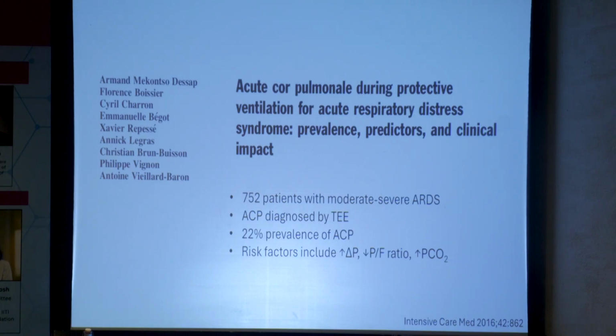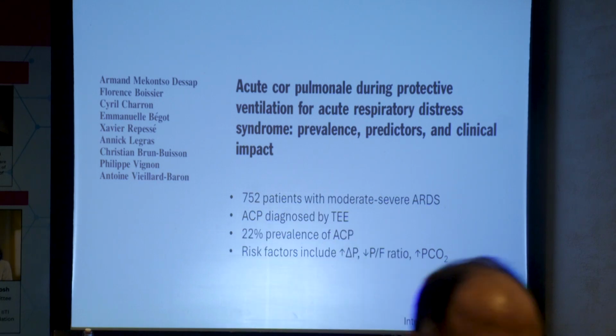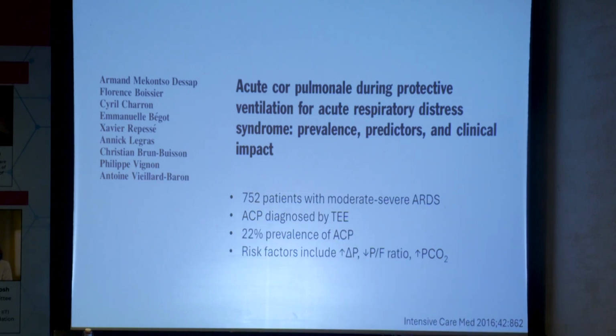I have a question regarding patients with ARDS who already have central line catheters. Often we don't think about ECMO when we're placing them. So they may have a right IJV catheter, and there is a certain subset who do develop thrombosis around that line, especially when they've had multiple cannulations. So if the patient has had a proven DVT, could you still cannulate through that if you do not have any other option?